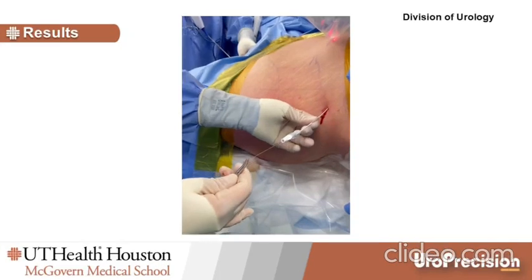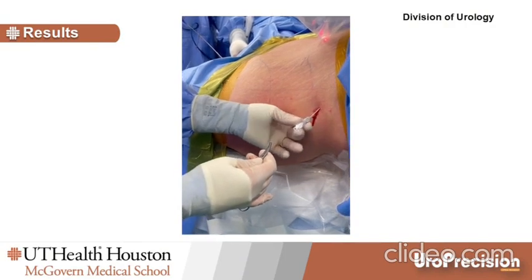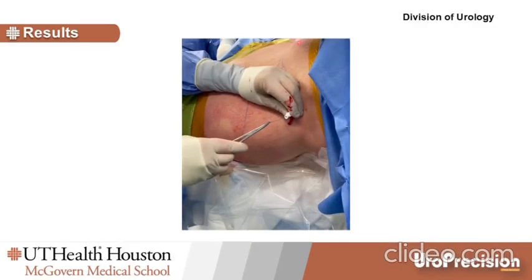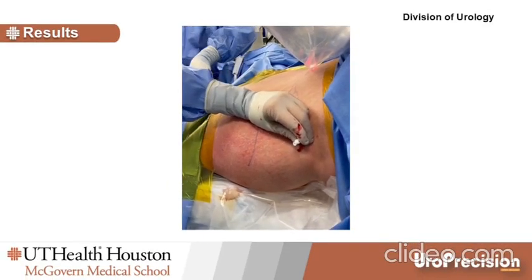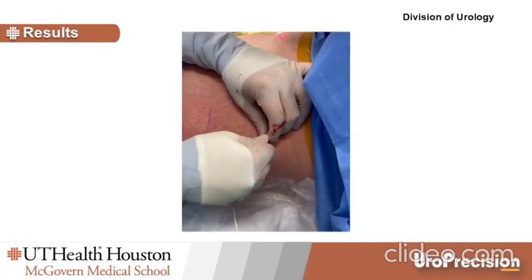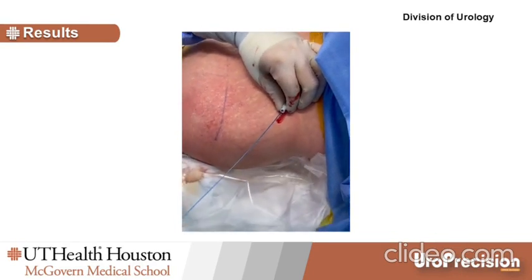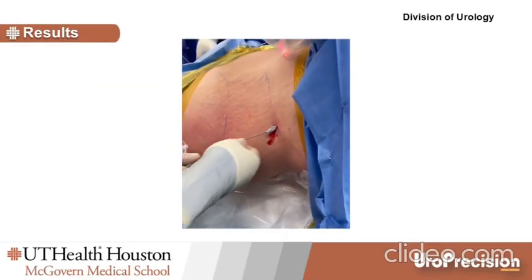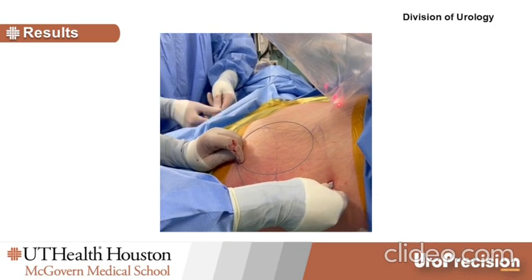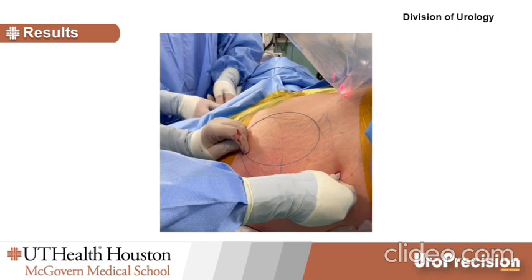Once the coaxial catheter is seen inside the collecting system endoscopically, the ureteroscope is retracted and the catheter is advanced until hubbing the skin. The clamp is removed, and both the ureteroscope and the puncture wire are withdrawn, leaving only the outer coaxial dilator and ureteral access sheath in place. After introducing a new working wire anterogradely, the coaxial catheter is removed, establishing through-and-through access, allowing the surgeon to proceed with renal dilation using their preferred approach.